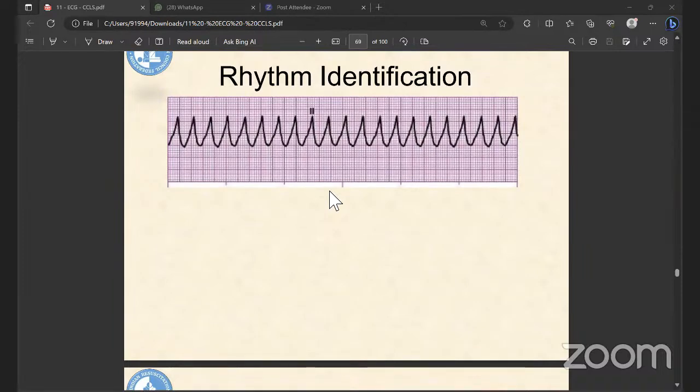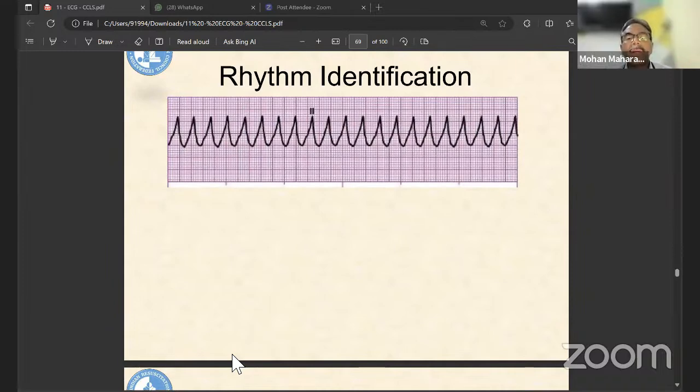We are going to have this exercise practically also, but practically, when you see a rhythm, you need to decide if it is life-threatening or not and what management it requires, and decide the strategy within 15-20 seconds. So he will quickly run the slides and you identify the rhythms. You can write down in the chat box so that we can quickly finish up. Just 3 minutes.